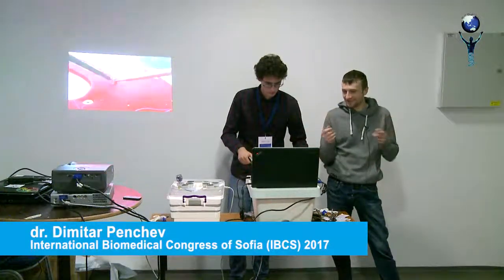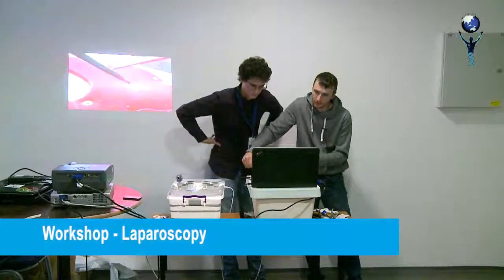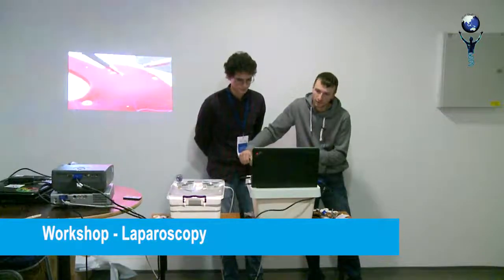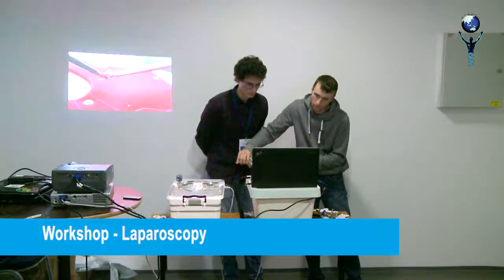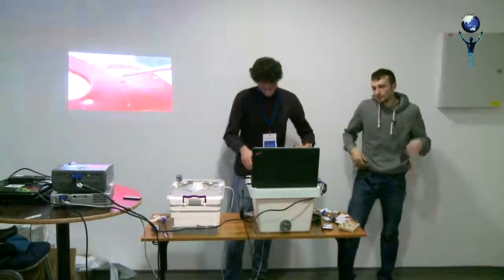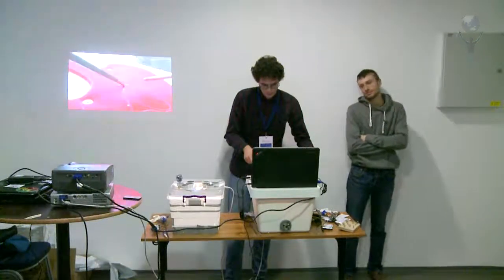Come closer to you. Yes, and now try to make this dancing needle rotation. Like this, let me show you. So if you grab it there, rotate the needle. When the needle is held in an appropriate position, you need to handle it with the right hand. Okay. So this is not an appropriate position. It's an advanced task. Just to show you how difficult it is, it's not necessary to complete these tasks.